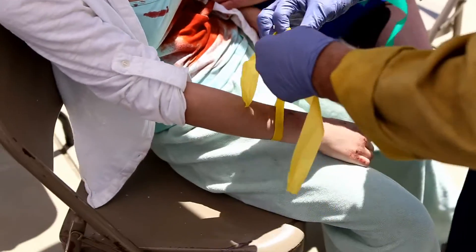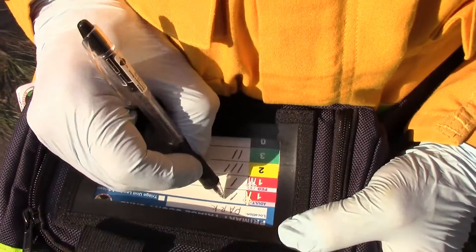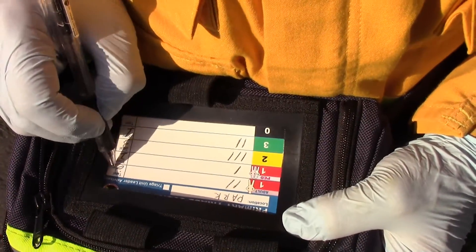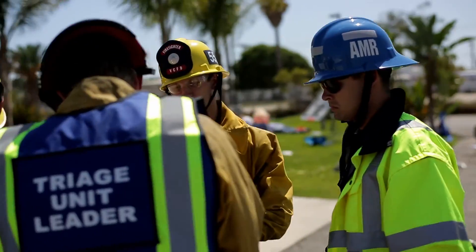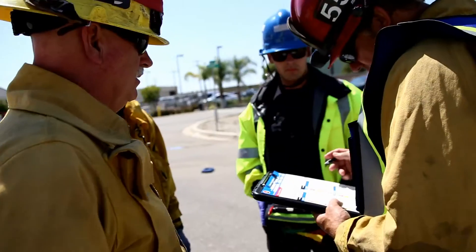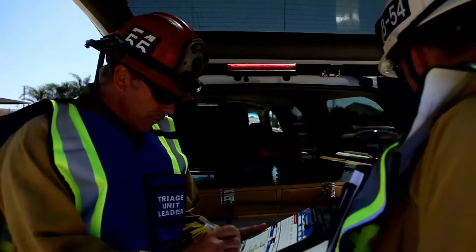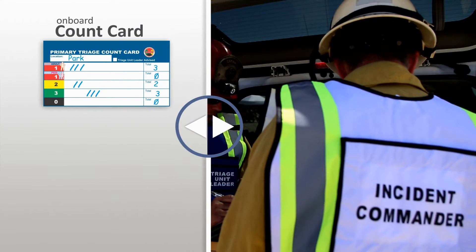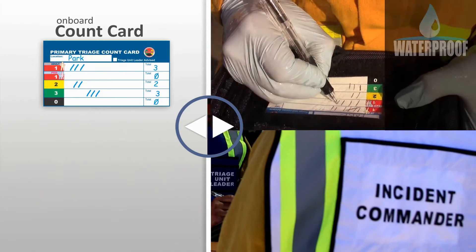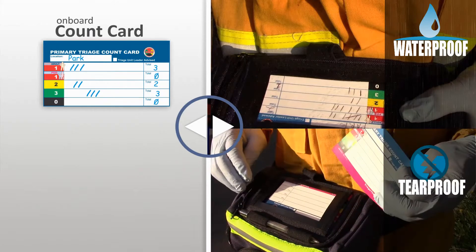Ribbon triage is a two-step process: application and count. The purpose of triage is to obtain an accurate tally of patients by acuity. That count must be recorded as ribbons are applied to ensure numbers provided to the triage unit leader are accurate. The most reliable and effective method of documenting a count is by utilizing a count card, not ribbon tips. The dispenser's onboard count card ensures accurate tallies in any environment, with redundant supplies and extreme durability to eliminate failures.